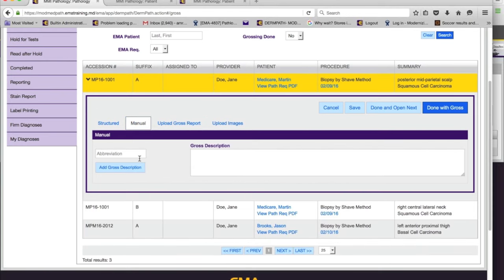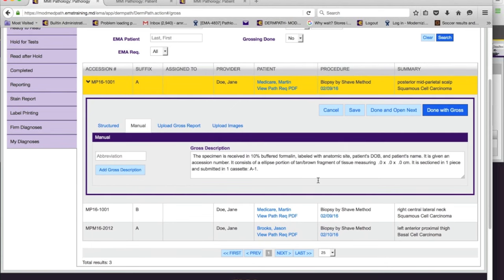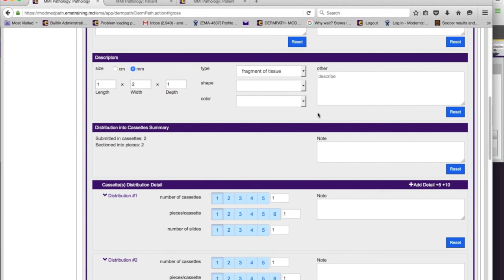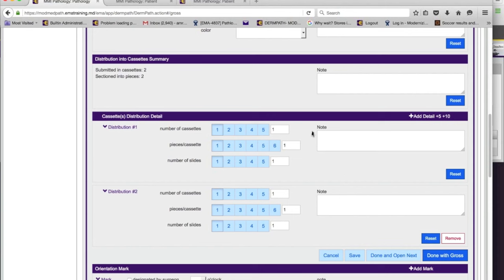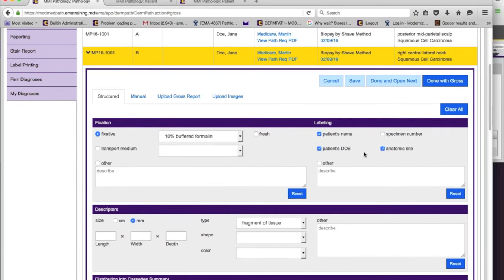For those who outsource the technical component, you can manually enter the gross description and set up macros. Here's an example I created before this webinar — a template for a possible gross description where you can fill in the size. You can create as many of those as you want if you prefer the manual route versus structured data. With structured data, there are more benefits because the module knows how many cassettes, pieces, and slides you've made, and can help generate slide labels and track productivity. If you're outsourcing the technical component, use the manual option.